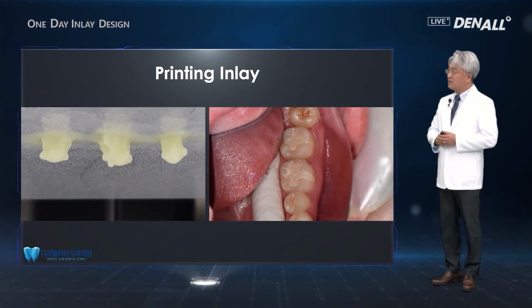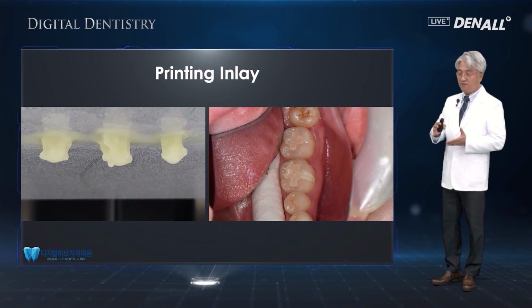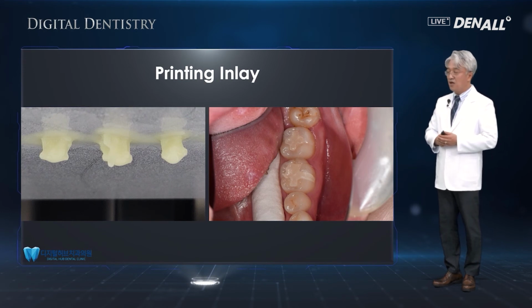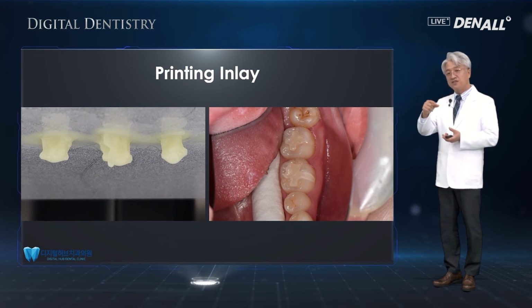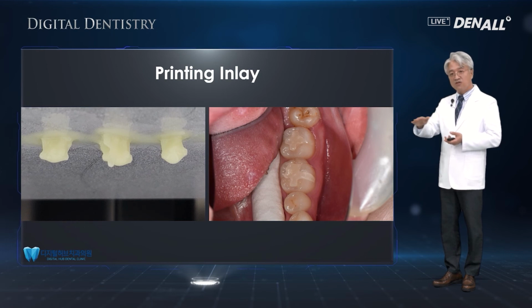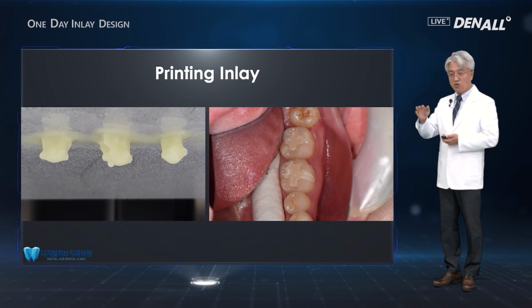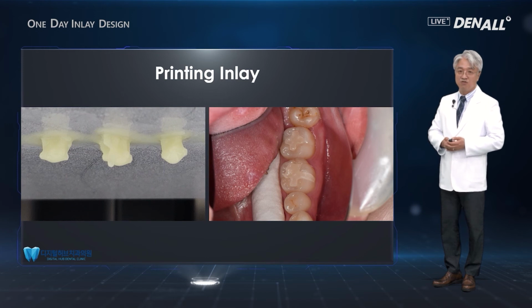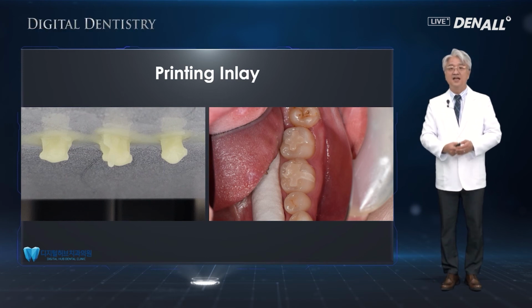The fit and others are now being improved, and rather than adapting with the support to the patient, support and other things are all removed before being delivered. So I think with such advancement, it can have much more satisfactory results.